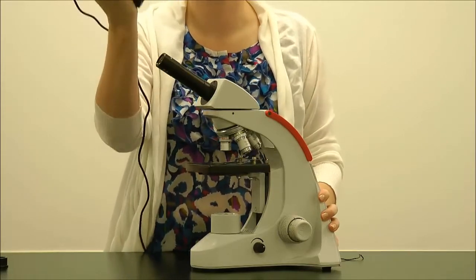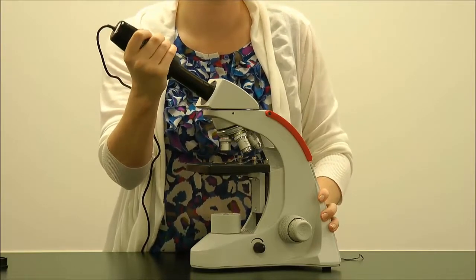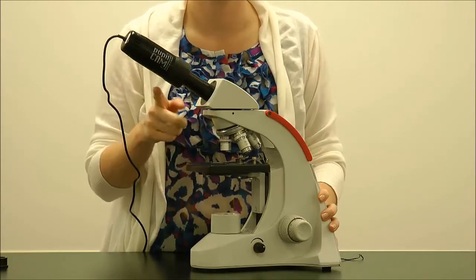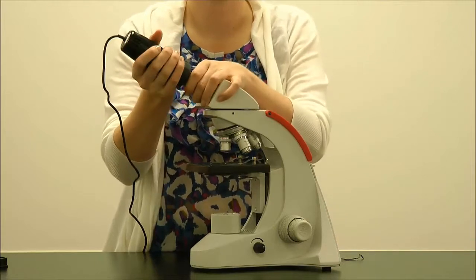Now your microscope has become digital and you can use Applied Vision 4 software. To remove the 1401K-RM PupilCam, use the same back-and-forth motion and gently pull it off the compound microscope.